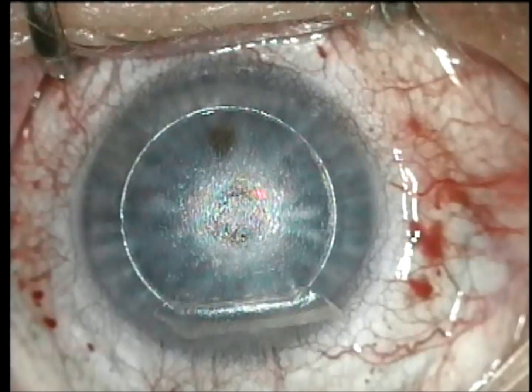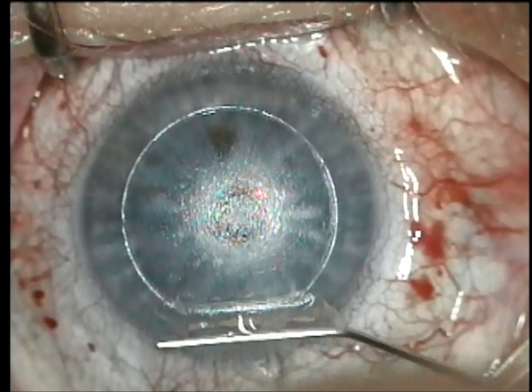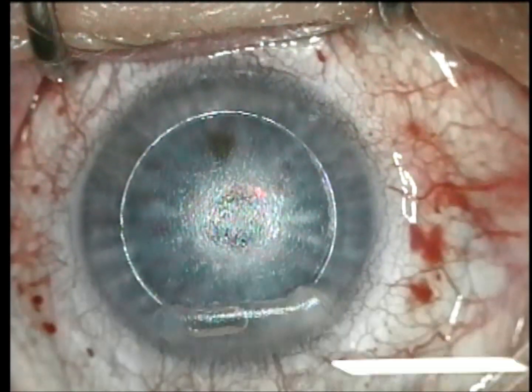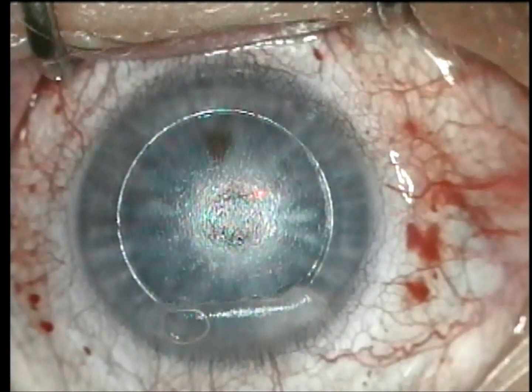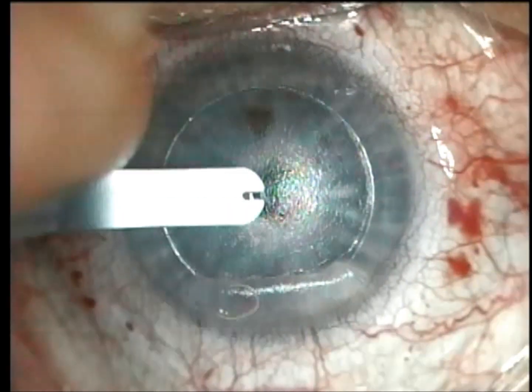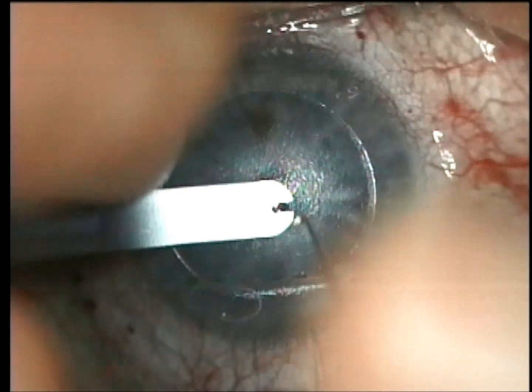I find it's important to always keep the flap moist even before I lay the raindrop down. You see me wetting with BSS and I'm using a 25 gauge cannula. I'm wetting the stromal side of the flap.